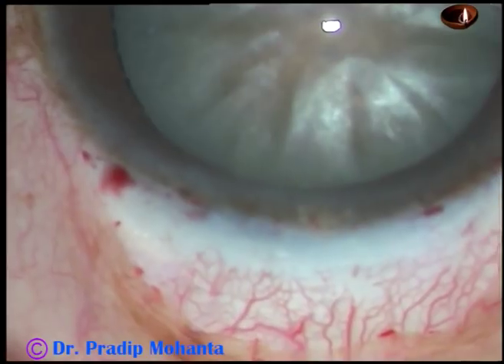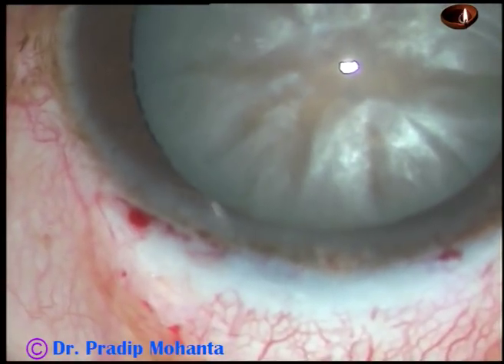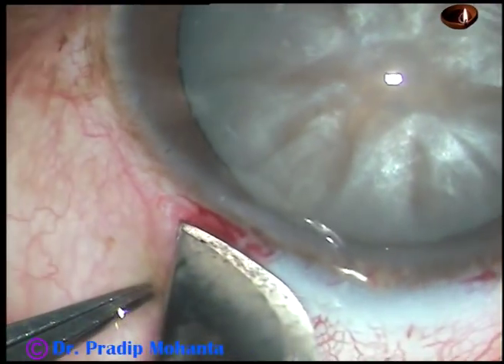A 15 number BP blade is used to make the incision just posterior to the limbus, about 1 mm posterior to the limbus.